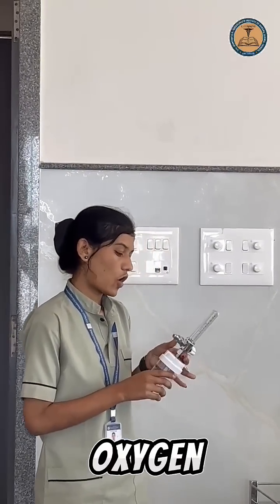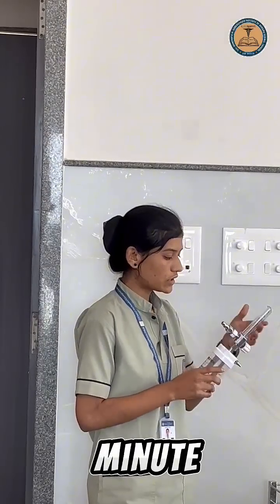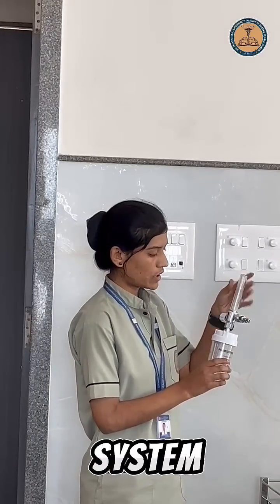Definition: an oxygen flow meter is defined as a device that controls the flow of oxygen from the oxygen cylinder or wall outlet to the patient in liters per minute, LPM. It is usually a part of an oxygen therapy system.